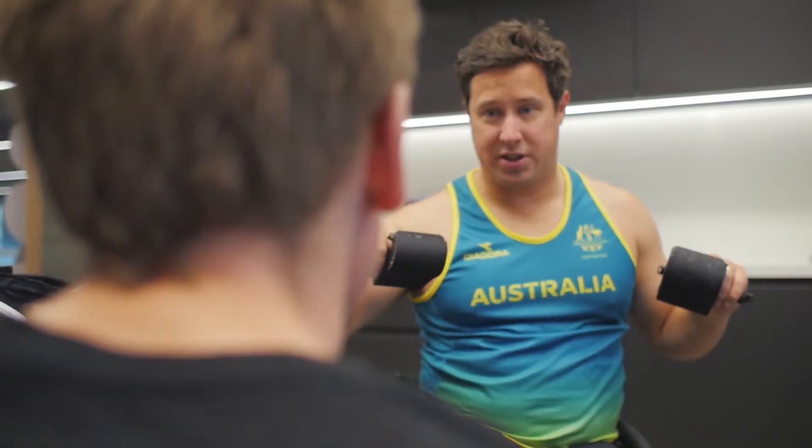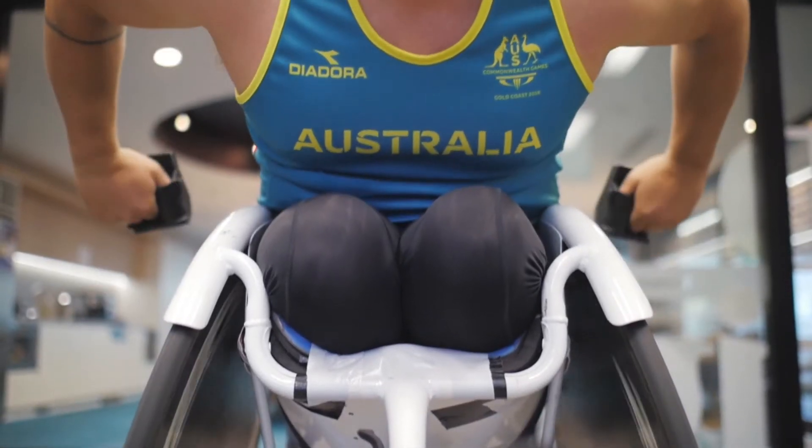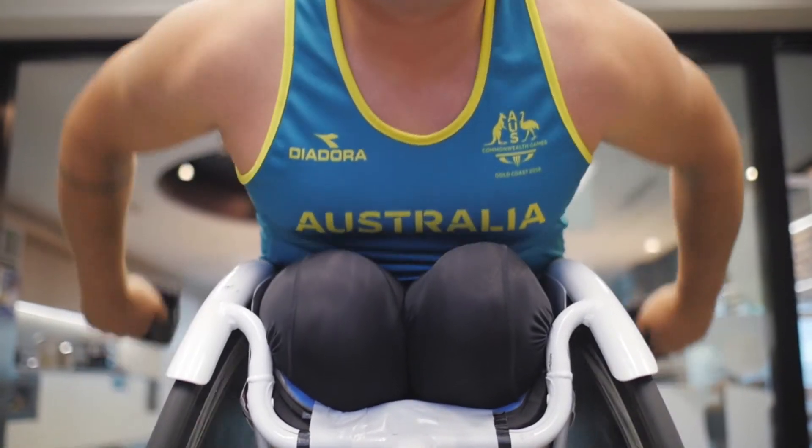The advantage of using the ThinkLab 3D printed customisable personal gloves was a massive advantage. Strong, reliable, custom-made to my own hands — it made a real difference.